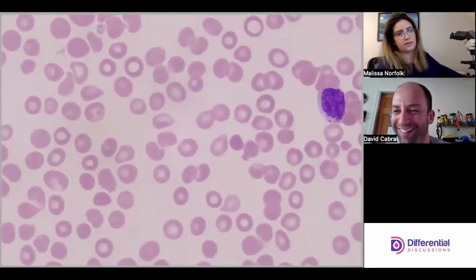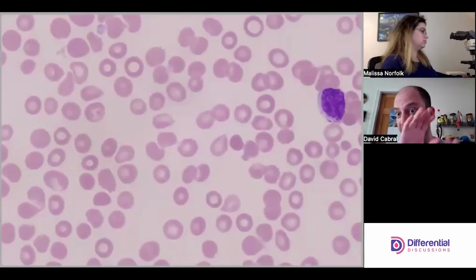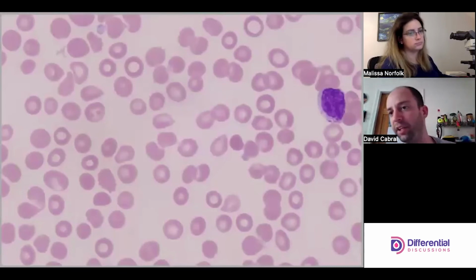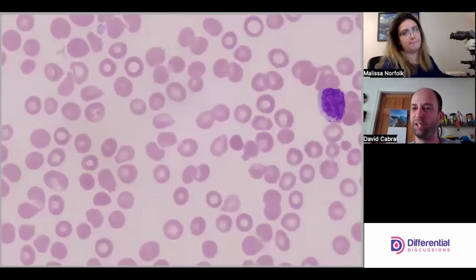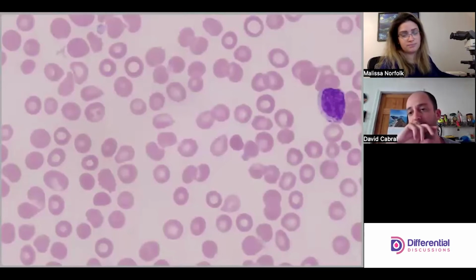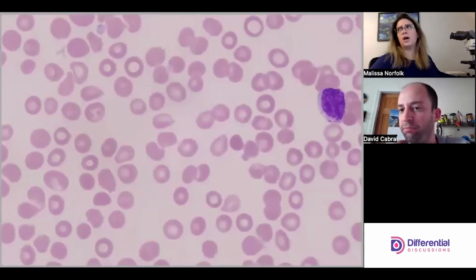The clumpiness is very different from the lymph, though. True. Yes. That's why it's not a lymph. It actually looks abnormal, and its nucleus does not look great. But on the spectrum of clumping versus that velvety smooth, it's definitely towards the clump side of things. Yep. But it's weird. The contours are bumpy. It's a little weird. But I can see students looking at that saying it's a lymph. Yeah. Because of the last one we just looked at. Yep. And again, I don't think it's like a grave sin. It's just not the best call.